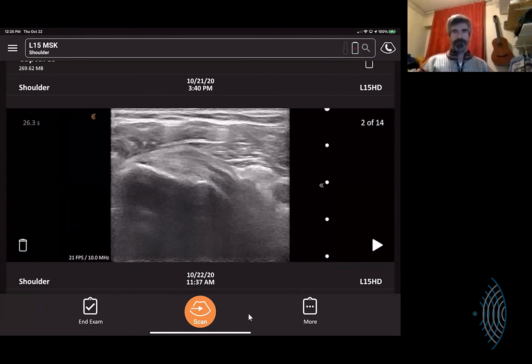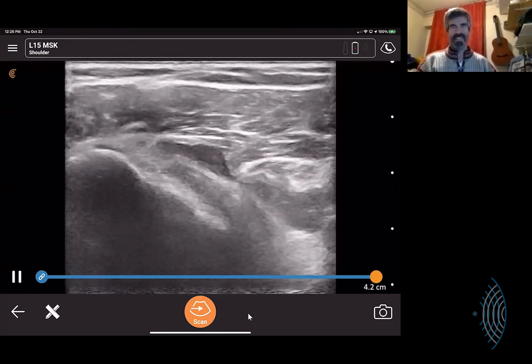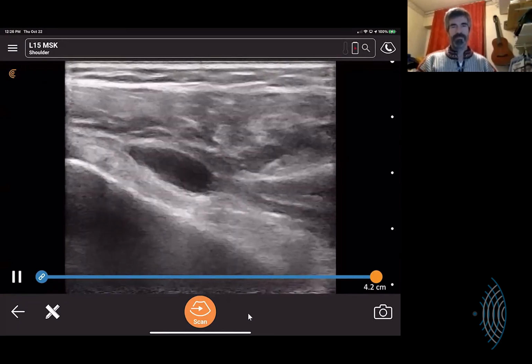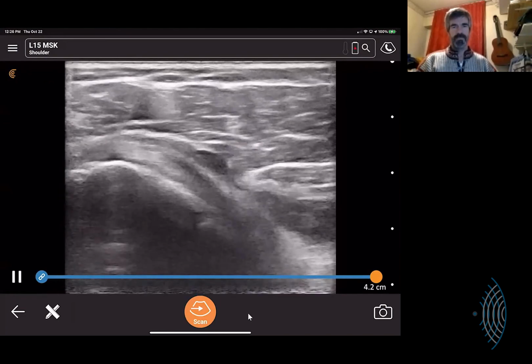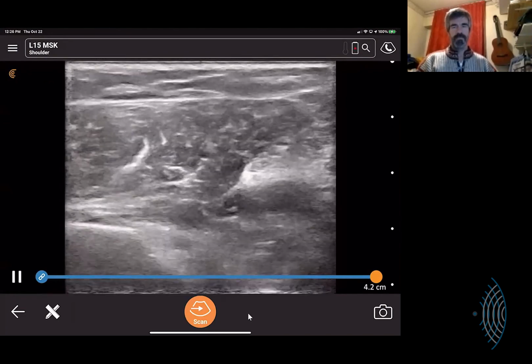It warms my heart that I'm seeing your head go up and down. That means at least you understand the echo texture of what I had. So I'm going to actually hit start here, and hopefully you'll start to see that as I was scanning to see what the footprint looked like, this little black area comes over the subscapularis, and I'm intrigued because there does not seem to be a communicating component across to the other part of the rotator cuff.